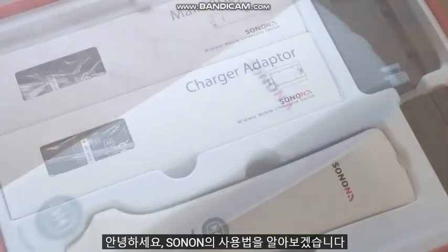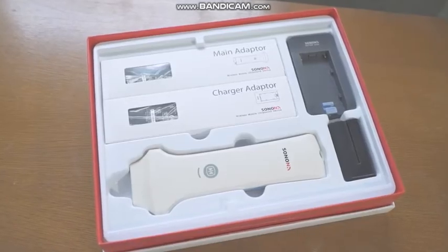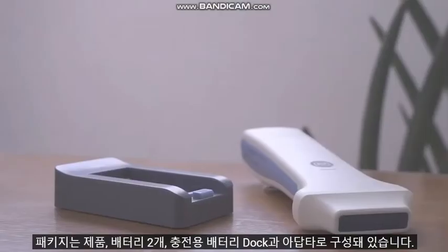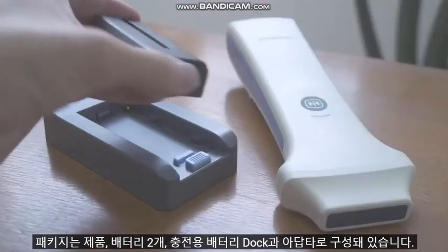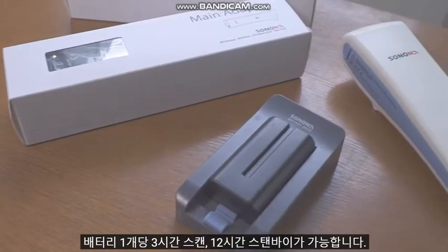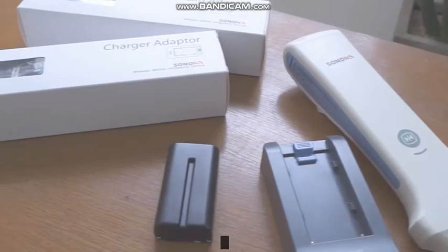Hello everyone! Let's take a look at the user manual of the Sonon application. Each package contains two replaceable batteries, a chargeable battery dock and an adapter, with a selected type of probe that can last up to 12 hours of standby and 3 hours of continuous scanning.